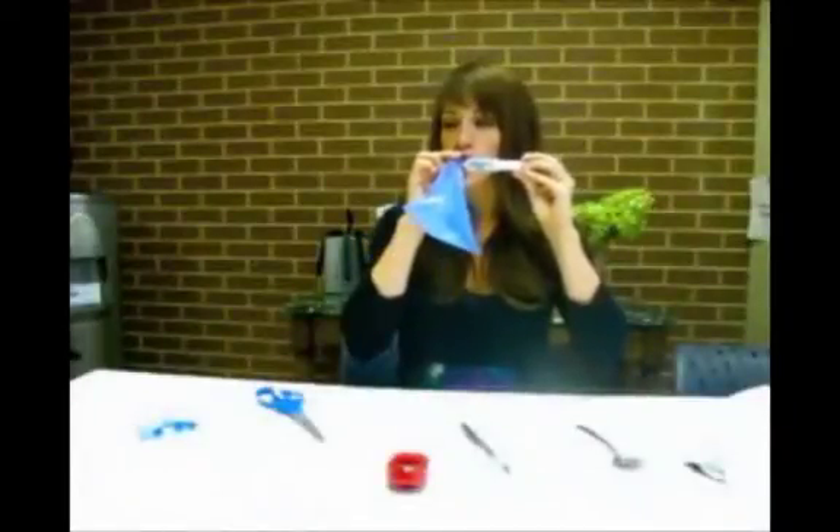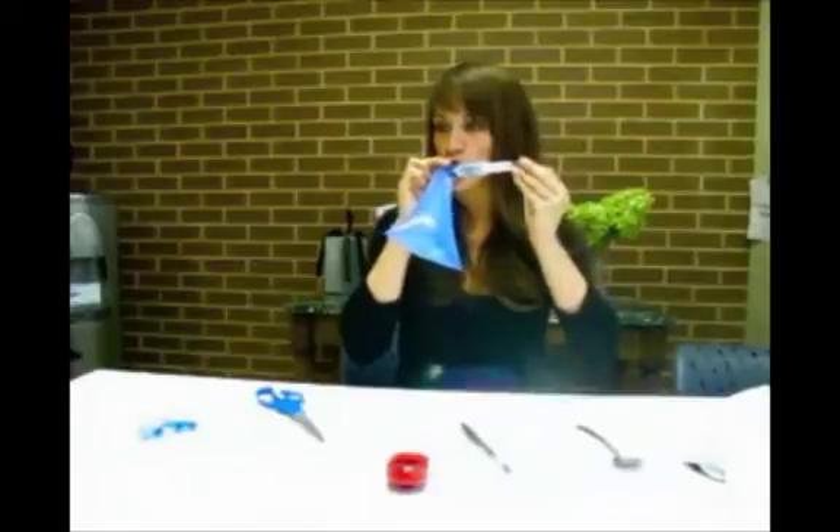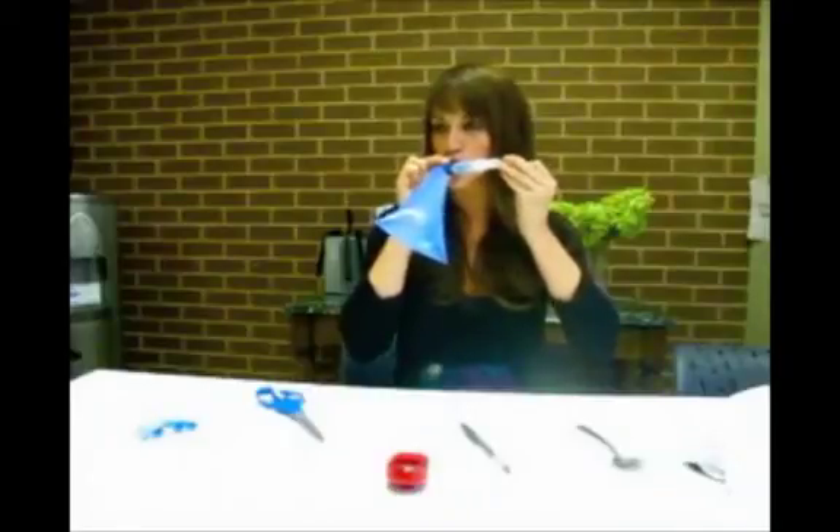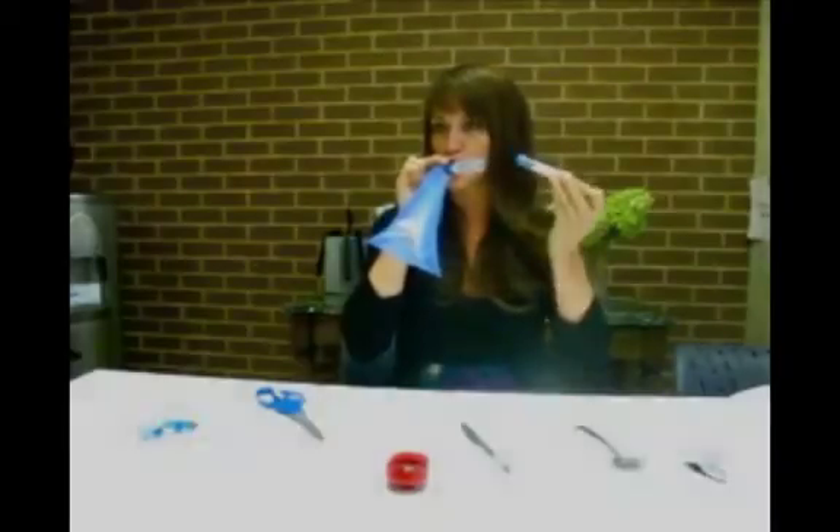Now it's time to perform the baseline breath test sample. Nearing the end of your breath, firmly push the test tube into the white tube, which has a needle covered by grey rubber. Let this stay for 2 seconds and release.